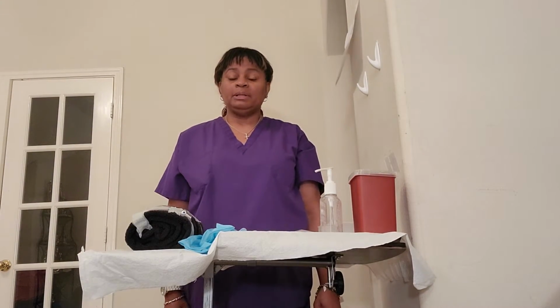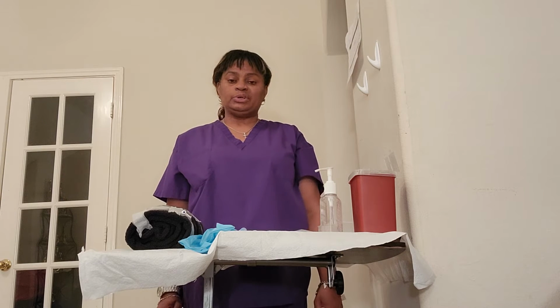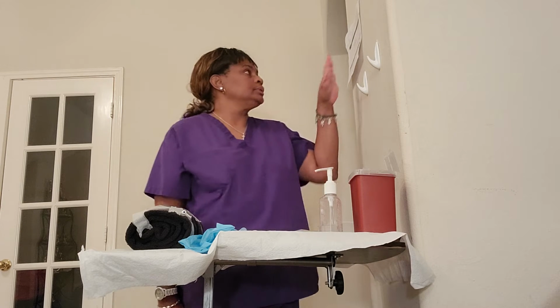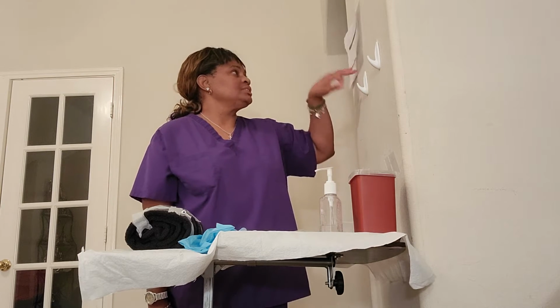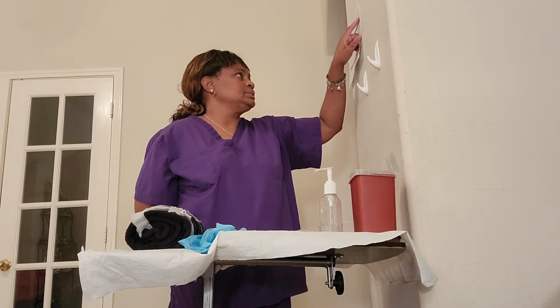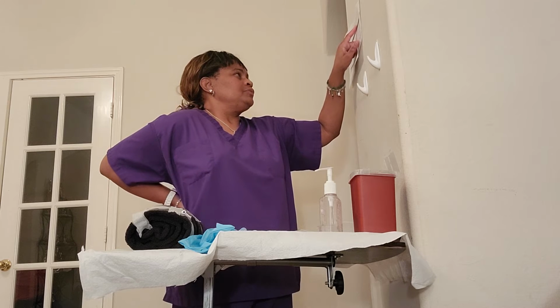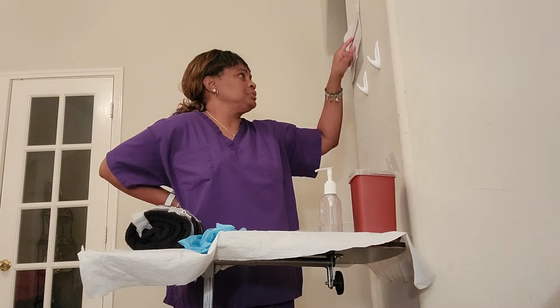Today I am administering IV fluids to Miss Millie Larson, date of birth 1/1/1936. First thing I'm going to do is assess the MAR and look for the fluids that are ordered. I've assessed the MAR. The MAR is for Millie Larson, date of birth 1/1/1936. The MRN is 123456, and she has no known allergies.